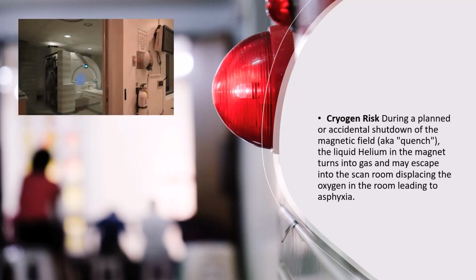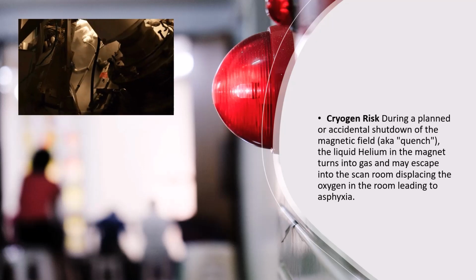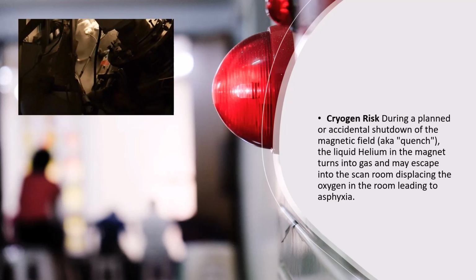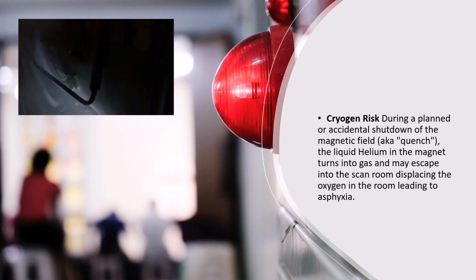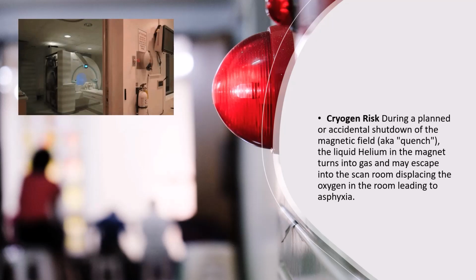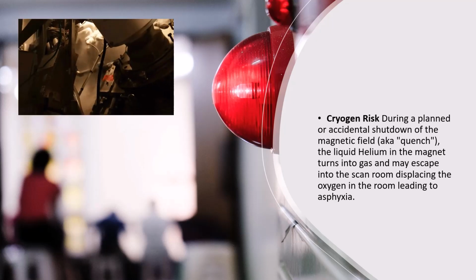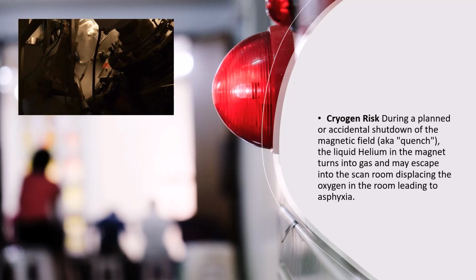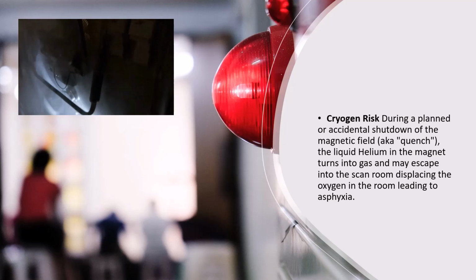Next, we'll look at the cryogen risk, which would be from a quench that wasn't planned. A quench is when the liquid helium in the magnet turns into a gas and may escape into the scan room, displacing the oxygen in the room and leading to asphyxia for anyone in the room. If a quench occurs, you need to get the patient out of the room immediately so that they can get some air.